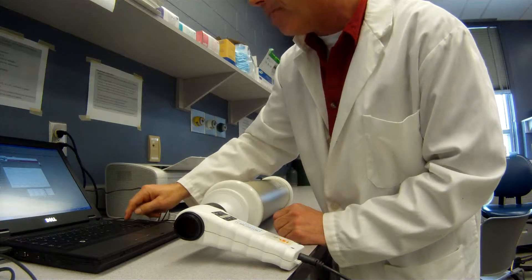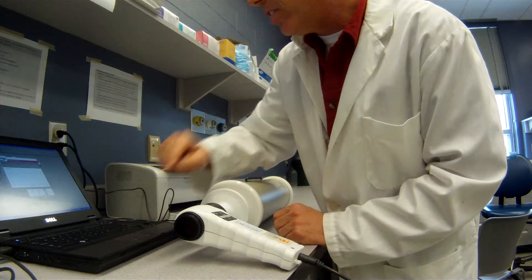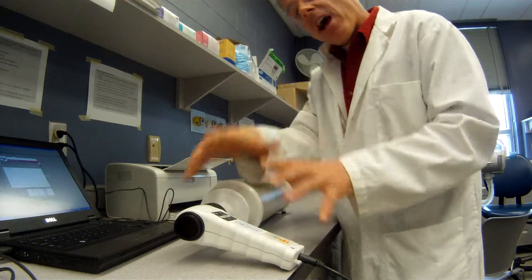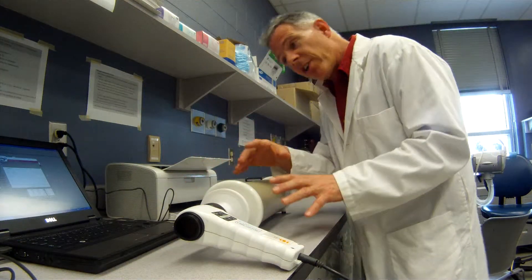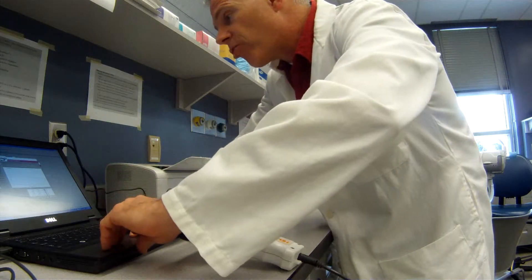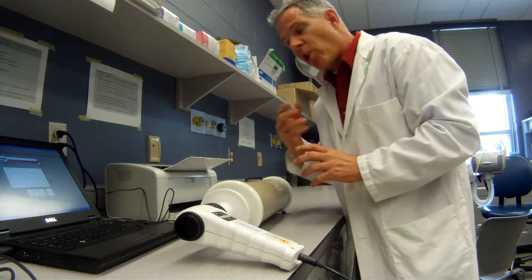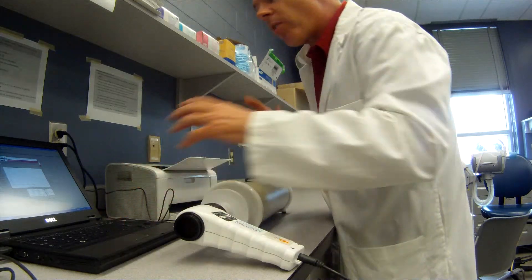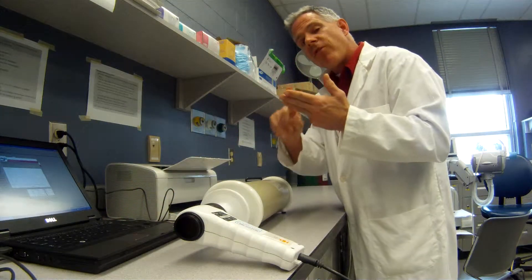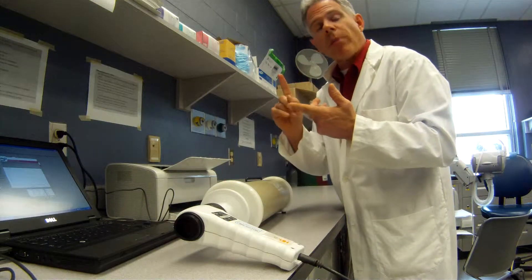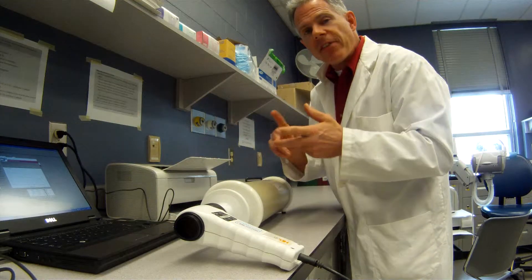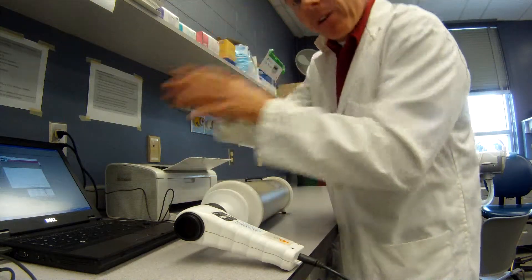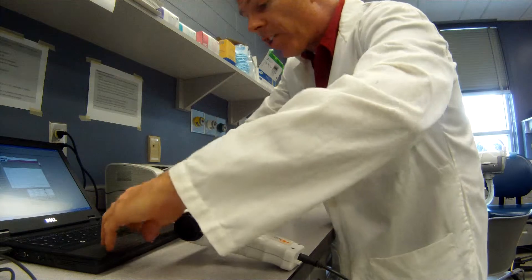Now we have to do a verification. We've calibrated the device and now we're going to do a verification to make sure it's working correctly. Now this is where you need to know a little bit about the American Thoracic Society guidelines, because it wants to make sure that we verify it for three flow rates: a low which is about 1 liter per second, a medium flow rate about 5 liters per second, and a high flow rate about 10 liters per second. It doesn't tell you this in the software, you just have to know that.